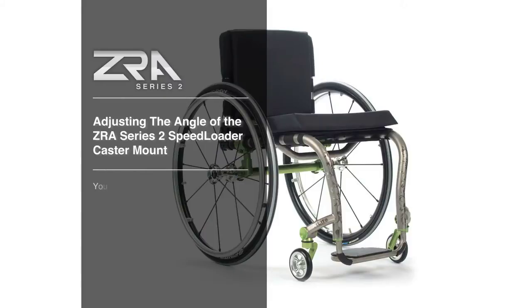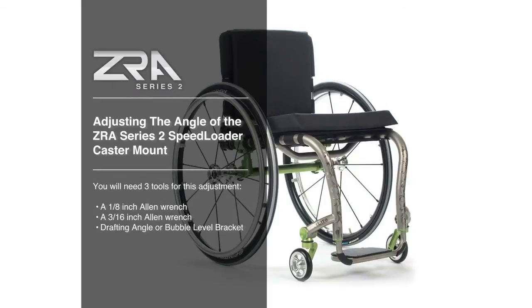Adjusting the Angle of the ZRA Series 2 Speedloader Caster Mount. If you have changed the seat height of your ZRA Series 2, you will need to adjust the angle of the caster mount to be sure that it is at a 90 degree angle to the floor. This will allow the chair to track straight.